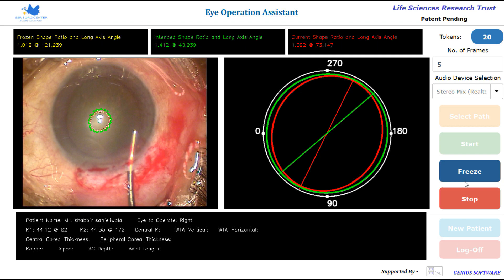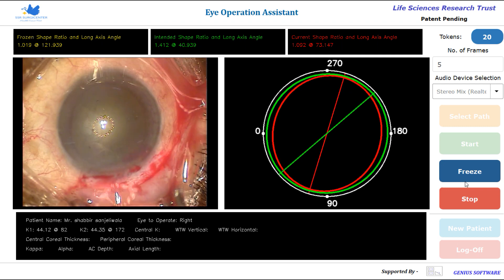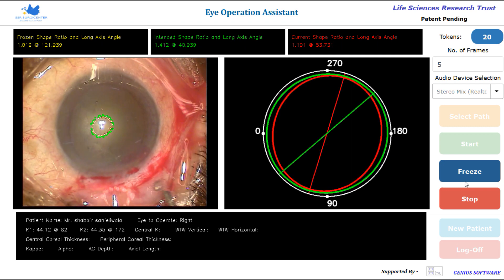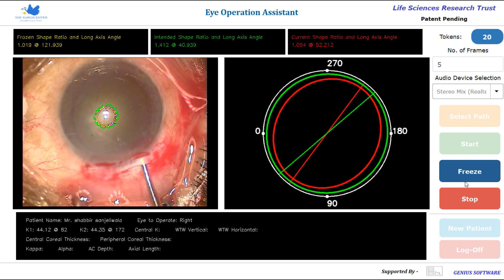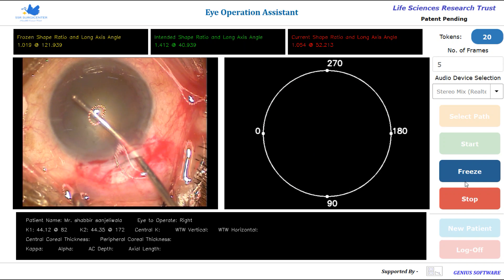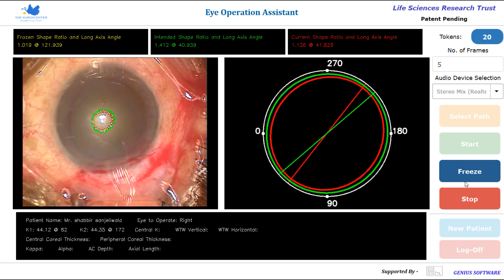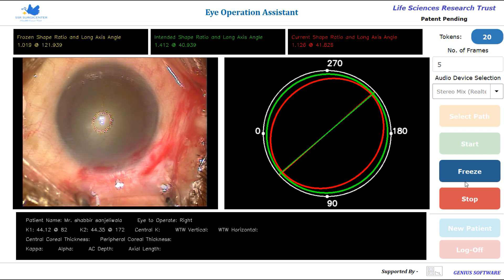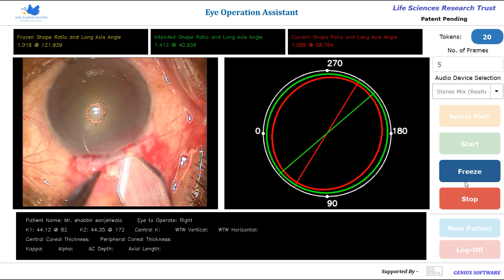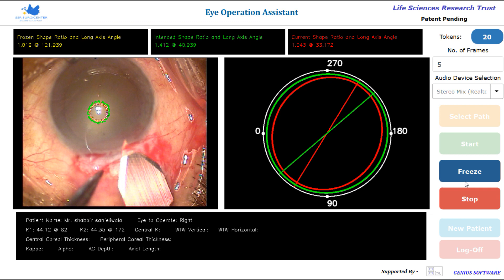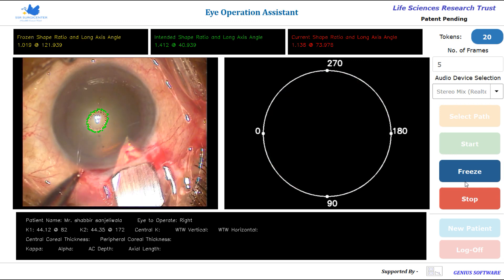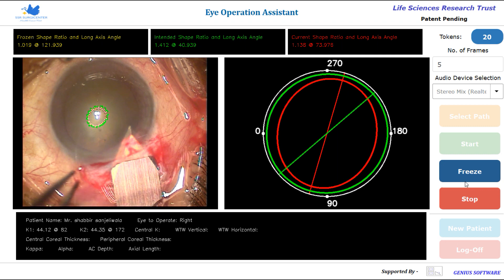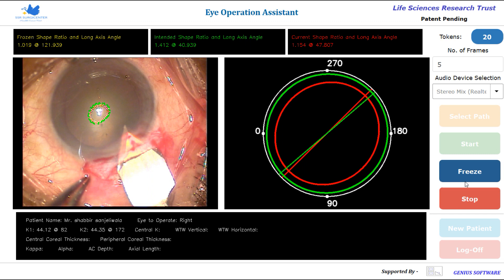Continuing software readings: Intended shape 1.41 at 40, current measurements 1.1 at 53, 1.05 at 52, 1.13 at 41, 1.09 at 51, 1.09 at 51, 1.09 at 58. Next cycle: Intended shape 1.41 at 40, current readings 1.04 at 33, 1.14 at 73, 1.09 at 45, 1.15 at 47.